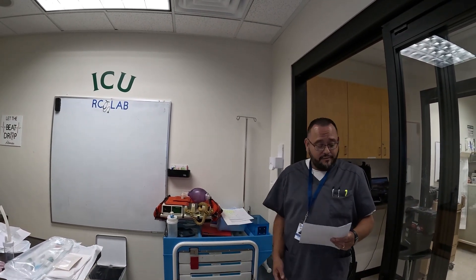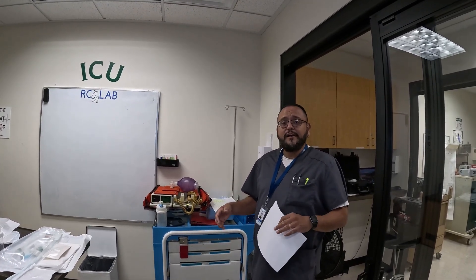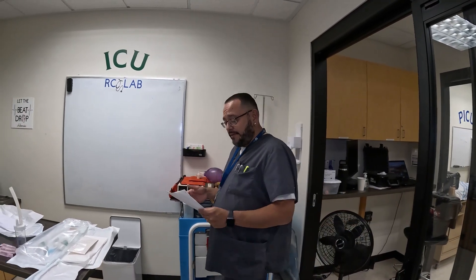Like anything else, you want to check orders and make sure you have an order for it. When you come in, you want to make sure you put your proper PPE on. For demonstration I'm not going to put gloves and all that on, but I would if we were doing it for real. So I'm just going to have everything set up and ready. You want to make sure you have your suction kit — I've already opened them up so I can show you what we have.